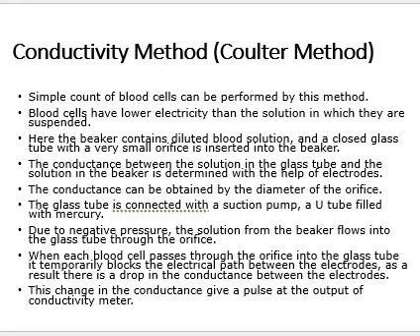When there is no passage of these cells, electrical conductivity takes place through that hole. And if any cell passes through that hole, it stops the conduction.